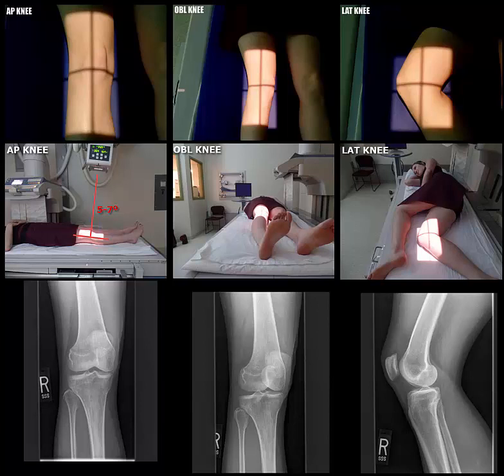When performing a knee series, there can be many variables that determine which views are needed to complete a series. In this particular video, we are going to explore the AP, the oblique, and the lateral.